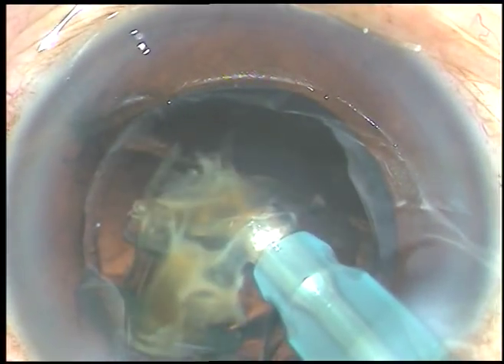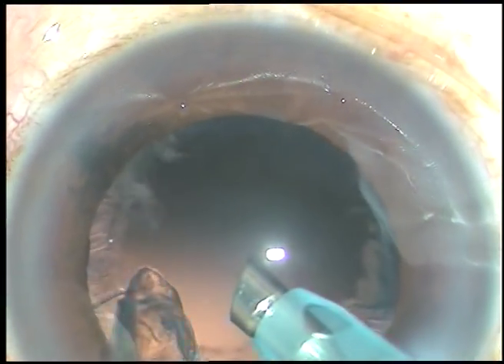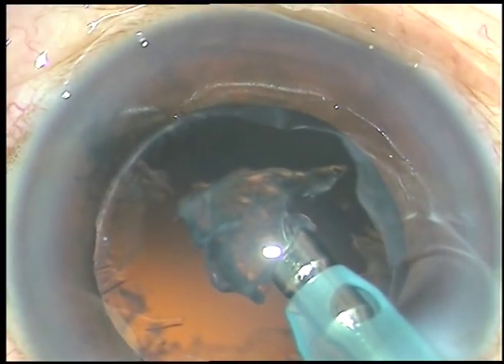Emulsify the other pieces. This is the last nuclear portion. Remove the chopper at this time. Remain at the center, and the anterior chamber will be more stable because leakage from the side port will stop.